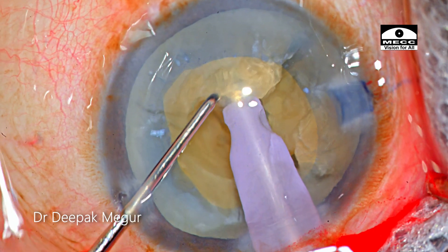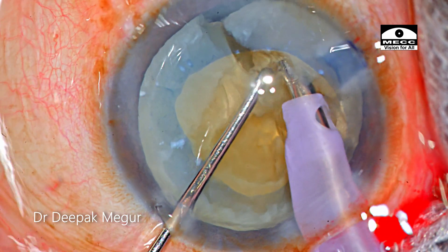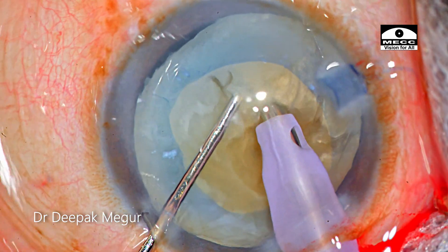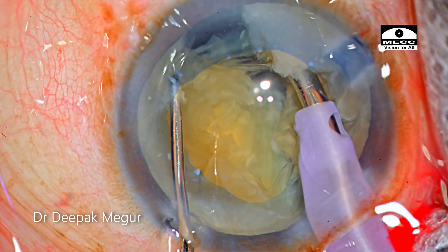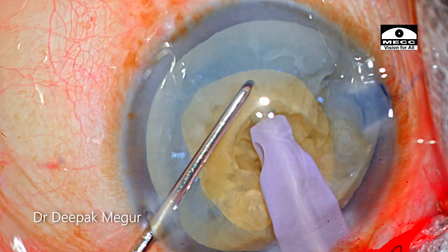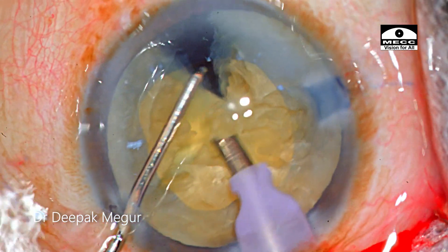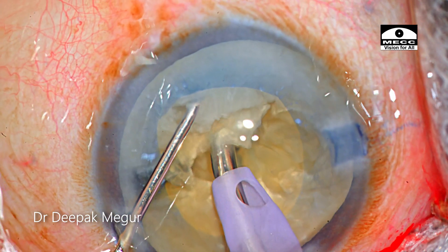The tip is again buried deep until the sleeve is reached, and then the chopper goes down a couple of times until we see a through-and-through crack. The nucleus is not so hard — although the color is brown it's relatively brittle and not very difficult to break the posterior plate. Dividing the nucleus into smaller pieces is not a big deal, but I wanted you to learn the finer nuances of how to bury the phaco tip deep. The critical factor is to have a firm grip — that is the only secret to a good vertical chop.